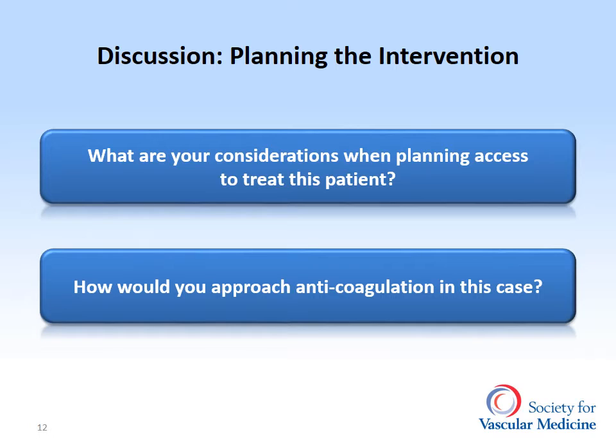Again, there are a number of considerations with respect to vascular access site and anticoagulation. Favoring an ipsilateral retrograde approach are the good support and the fact that one can possibly cross and treat from a single access point. However, there may be a need to gain reentry directly into the aorta.